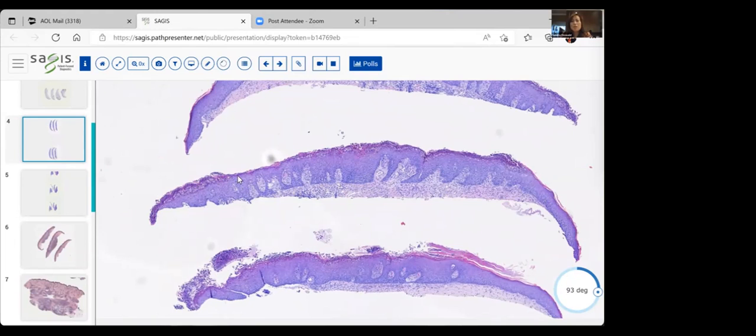And then you also see, sometimes it's more remarkable than others, but in this case you have some mild papillomatosis. That means undulation of the surface. See how it goes up and down, up and down, up and down. It almost looks like how condyloma can look, where you have condyles of the knuckles and the intercondyle spaces.